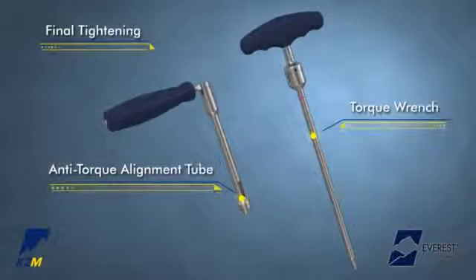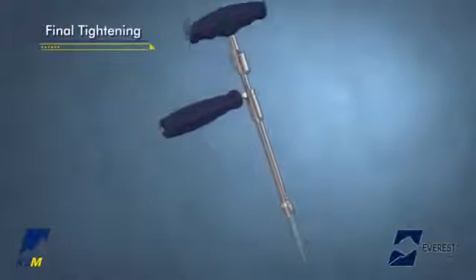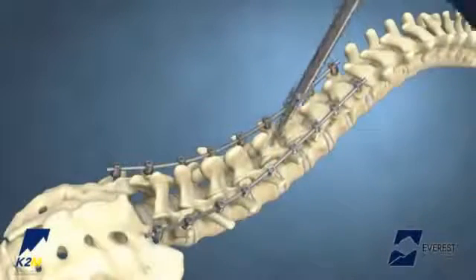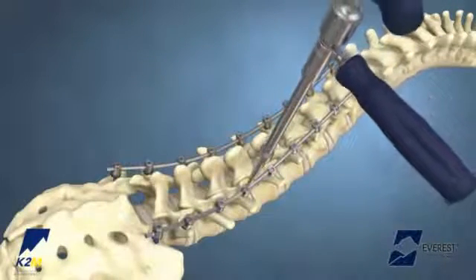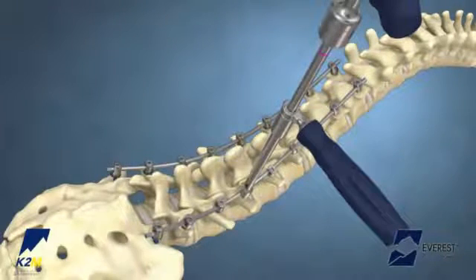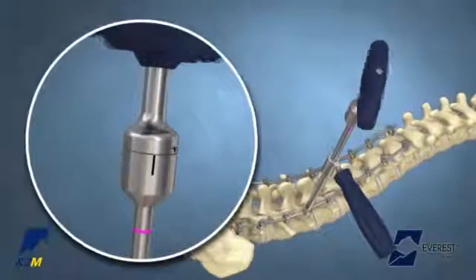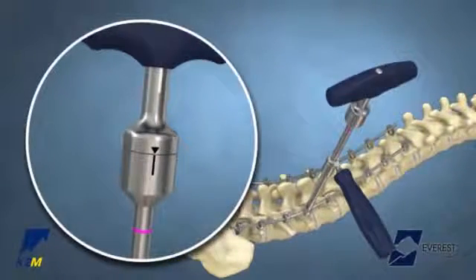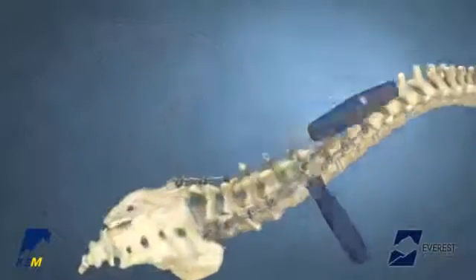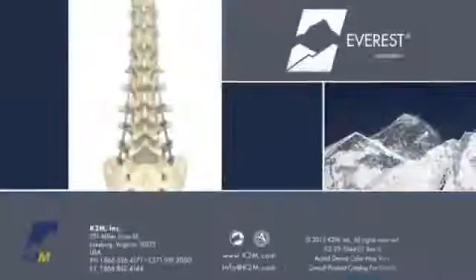Final tightening of the Everest implants is achieved using the one-piece anti-torque alignment tube and an Everest torque wrench. Introduce the torque wrench tip into the Everest Set Screw, then slide the one-piece anti-torque alignment tube down and engage the tulip head of the screw. Final tightening is achieved when the line on the torque indicating wrench aligns with the arrow. The Everest Deformity Spinal System from K2M, Complex Spine Innovations.